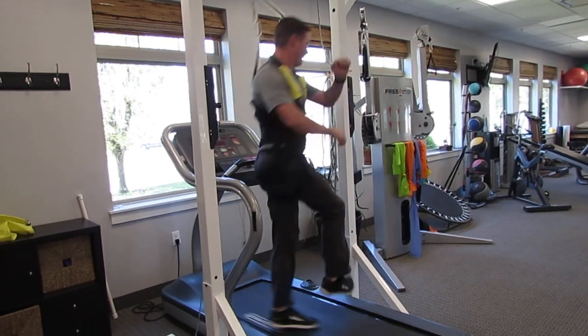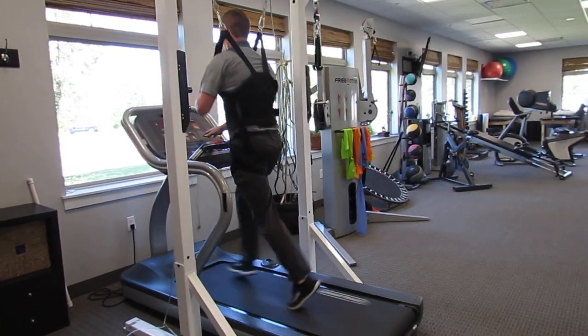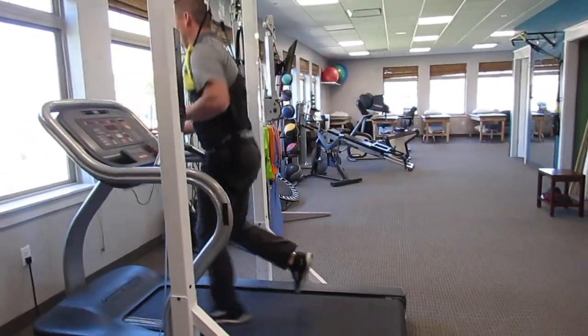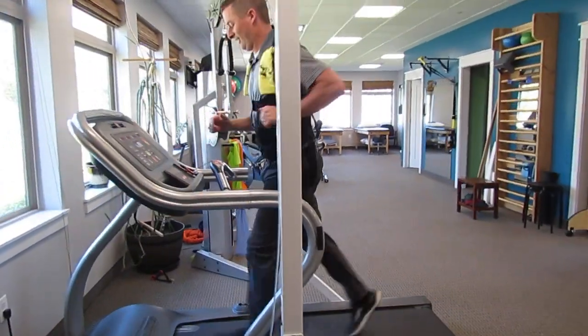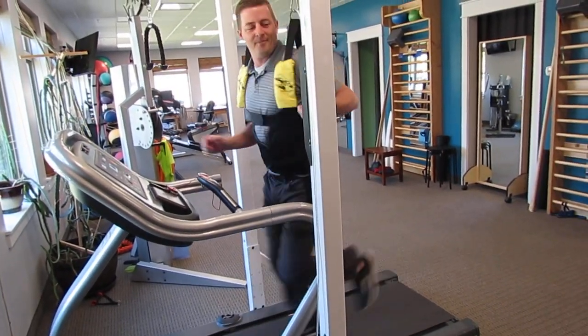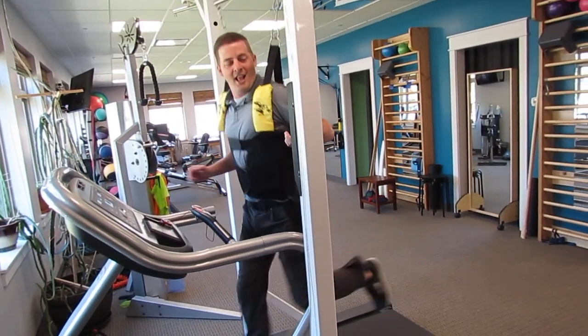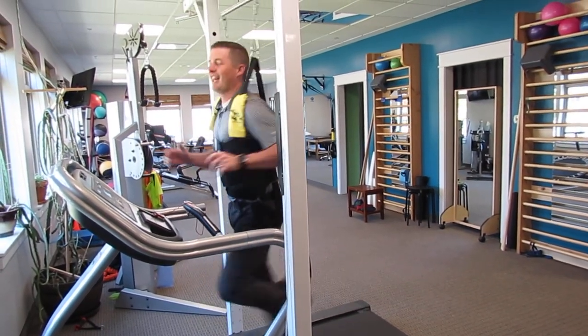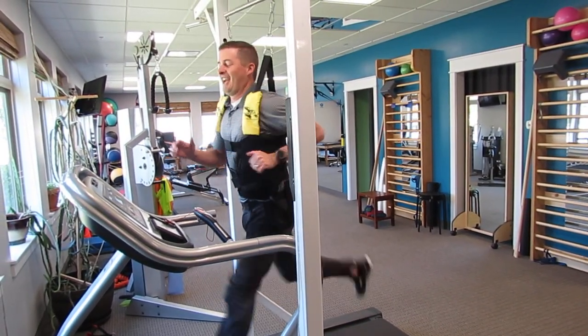Six miles an hour backwards, or we can max out the treadmill, take off more weight, and run — light as a feather — at 12 miles an hour.